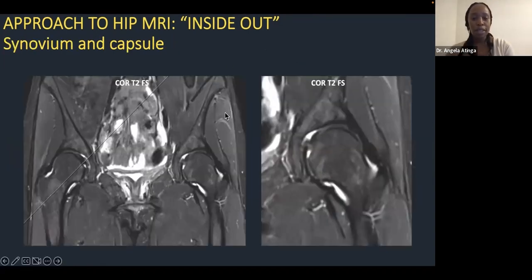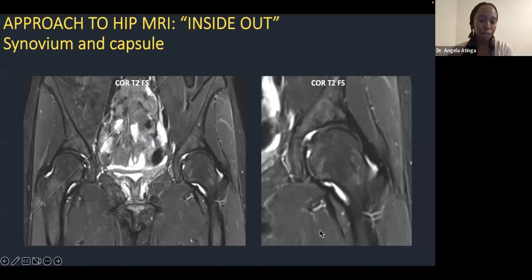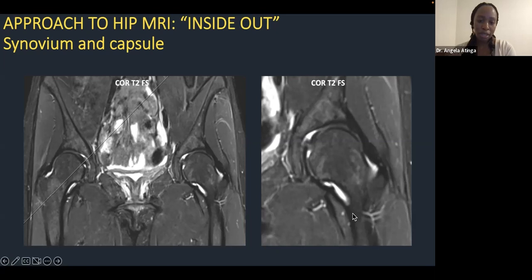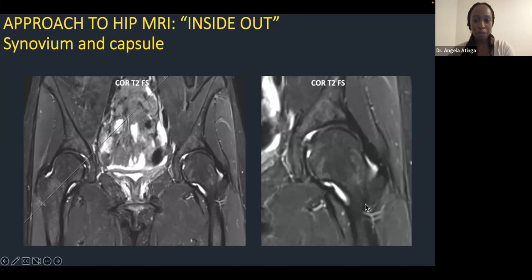Moving on to the synovium and capsule: on large field-of-view images, the synovium should be thin and uniform all the way around. The fluid in the hip is T2 bright but should be quite bland — no fronds or areas of hypertrophy. If you start to see that, think about synovitis. Also look at intra-articular bodies — bits of synovium that have fallen off, or mineralized bodies. Note that pericapsular edema is important to mention in reports as it signifies pathology, and in the shoulder there is adhesive capsulitis, which some people also report in the hip.